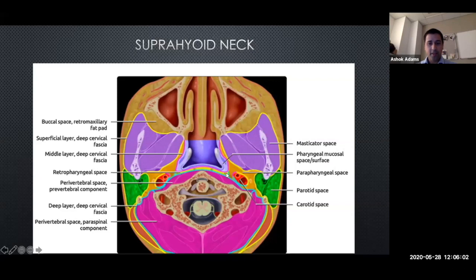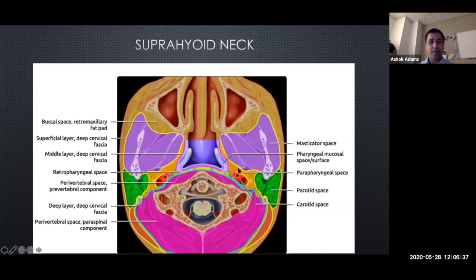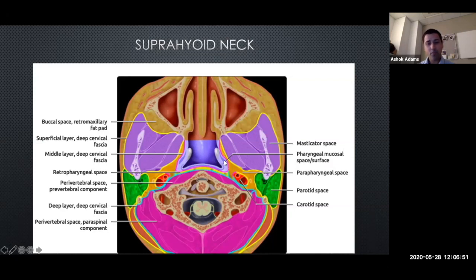Behind that is a superior extension of the retropharyngeal space, and laterally is one of the most important spaces - the parapharyngeal space. This is very useful for infections and tumors below the skull base. If you've got any lumps or bumps in these fascial spaces, displacement of this parapharyngeal fat can be a clue as to where the pathology is coming from. If it's a pharyngeal mucosal space problem - typically squamous cell carcinomas or minor salivary gland tumors - it will push the fat out laterally and posteriorly.